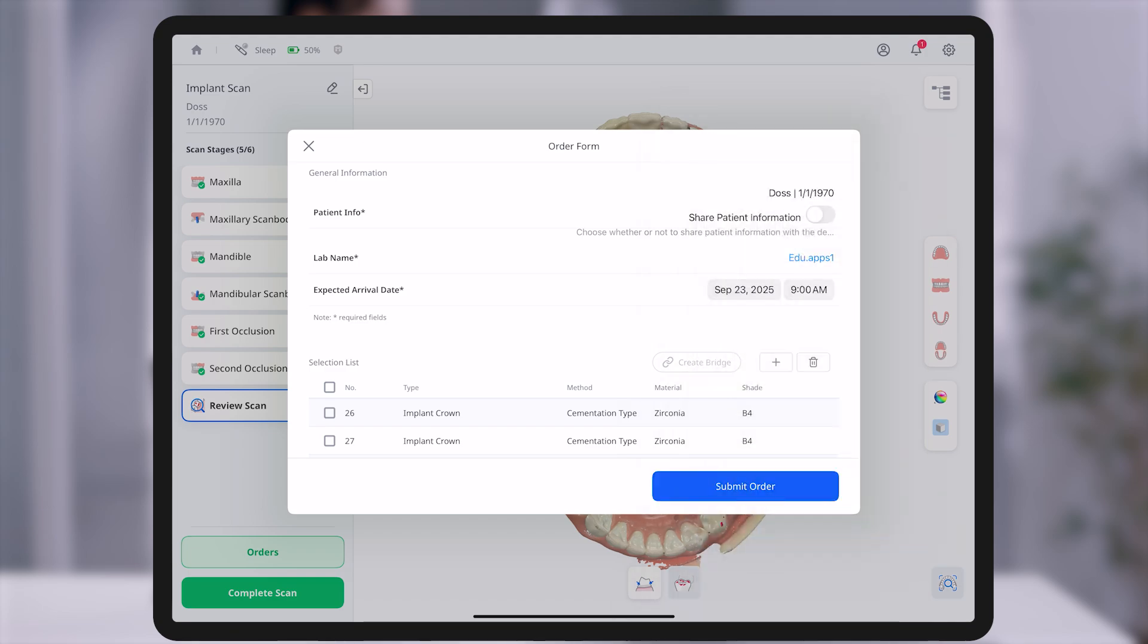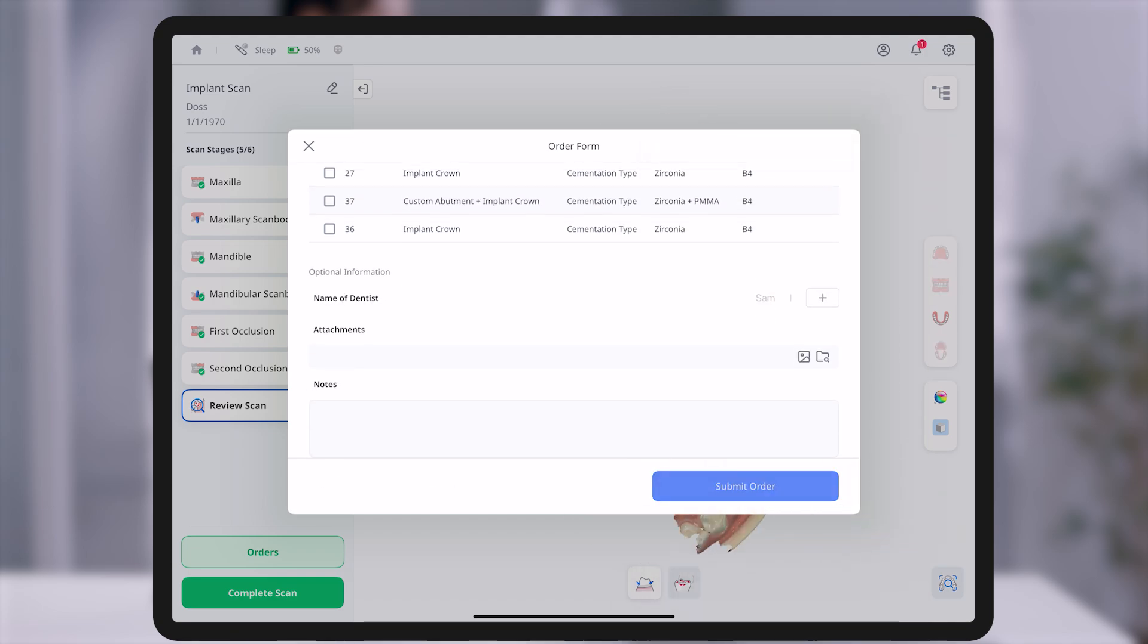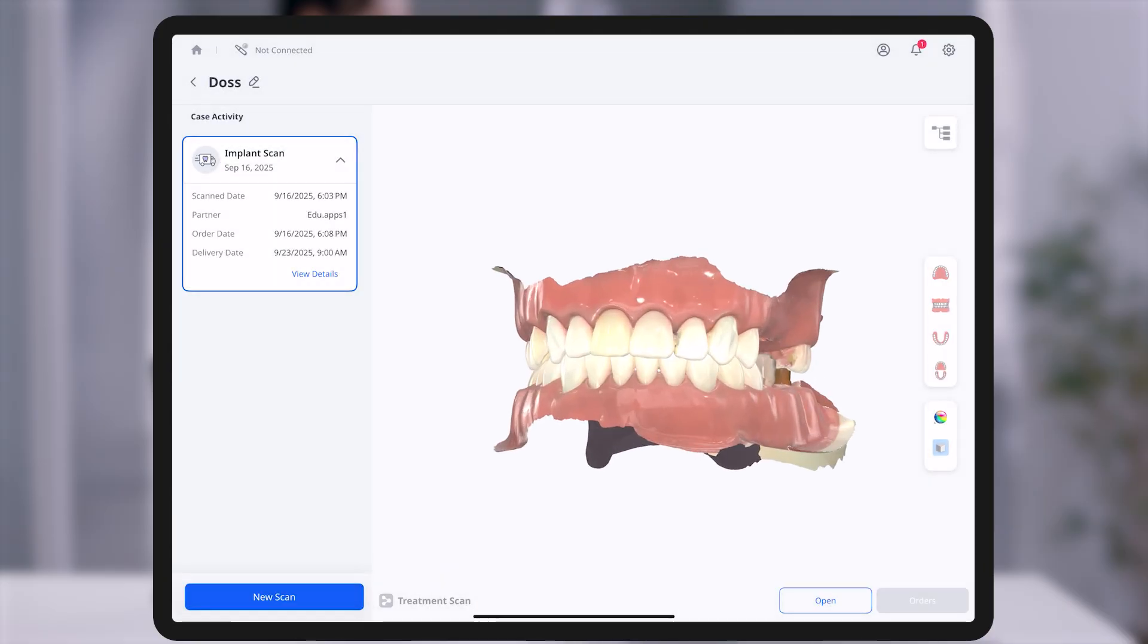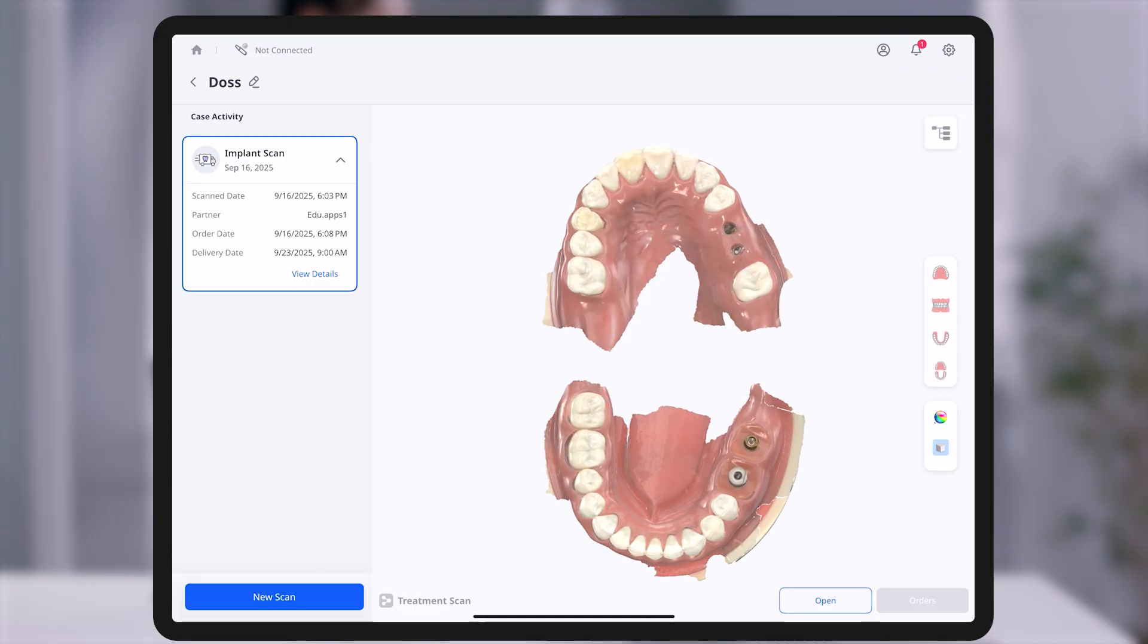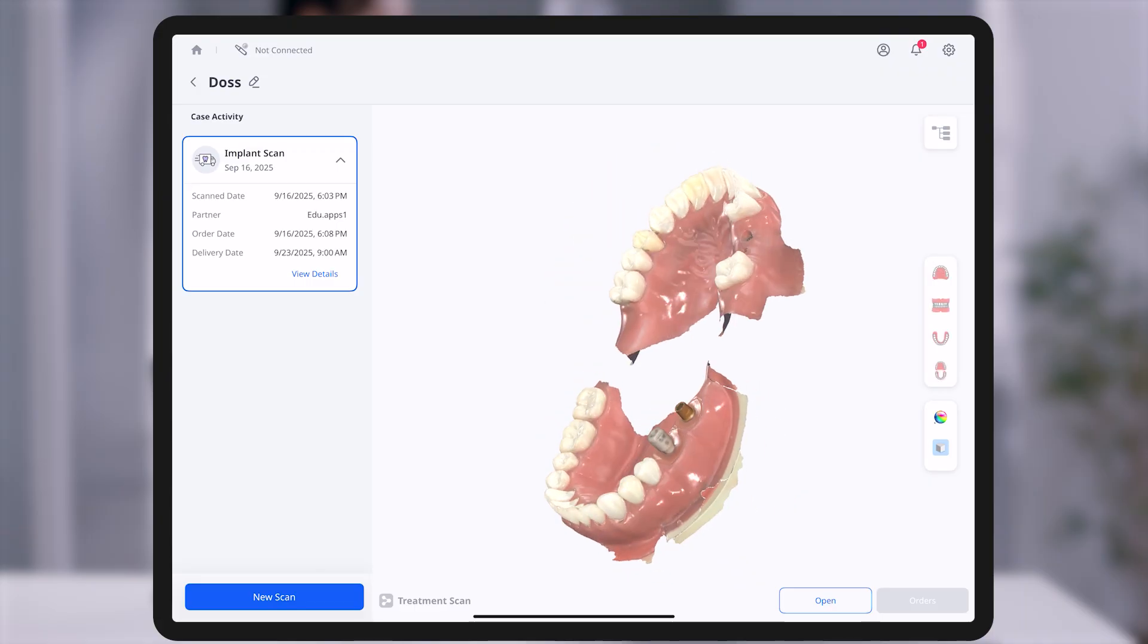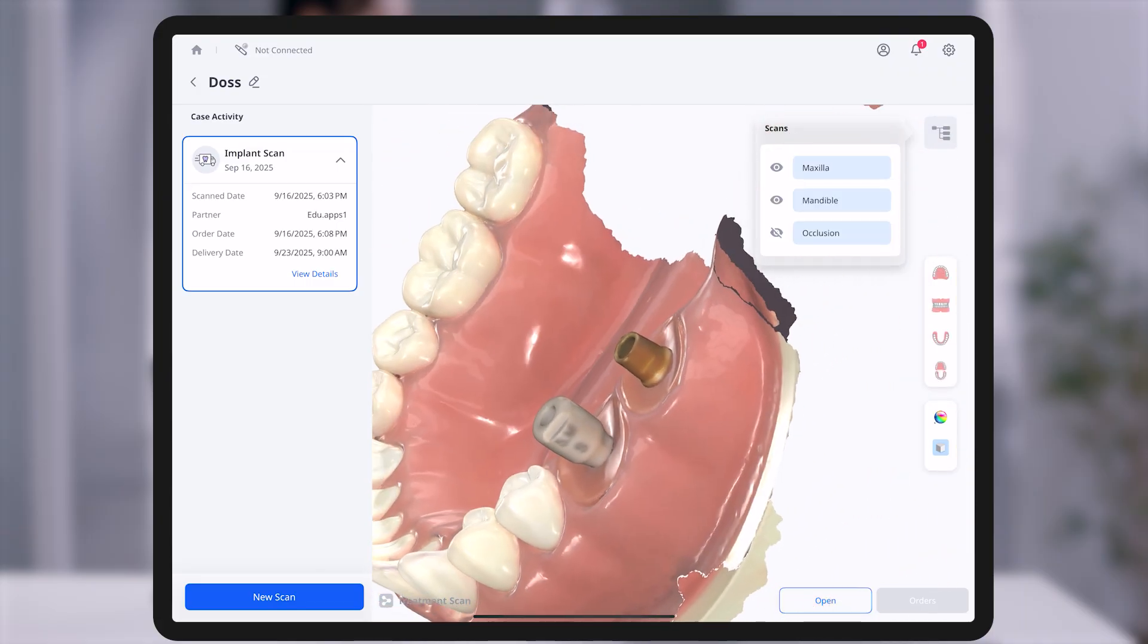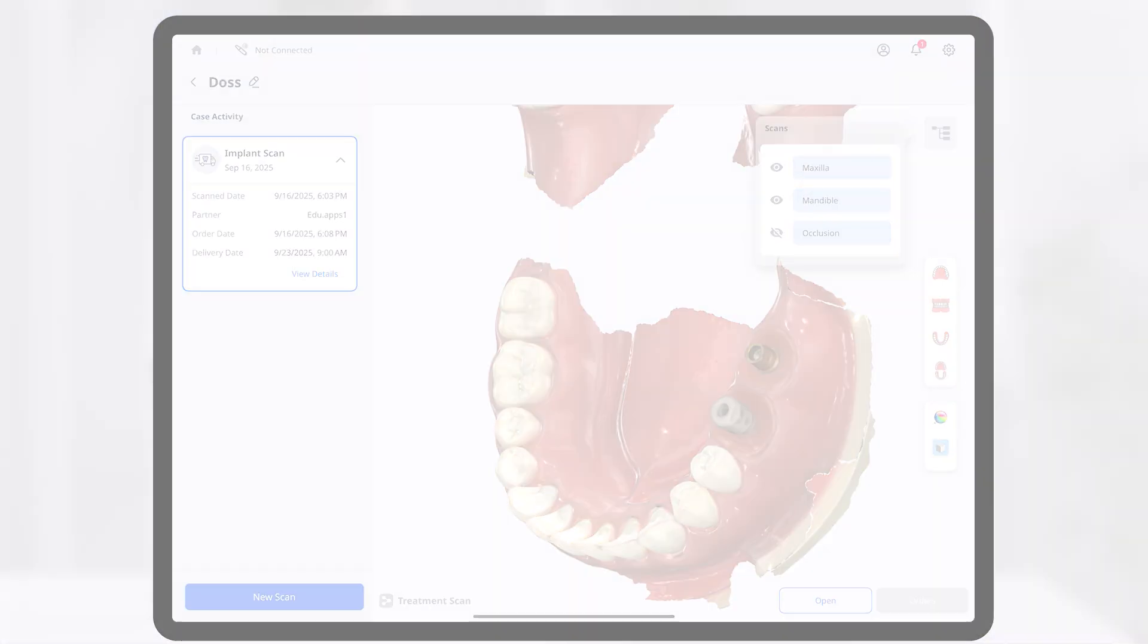ExpressScan is well-suited for quick and simple consultations, while TreatmentScan provides a detailed workflow ideal for accurate diagnosis and treatment planning. When your case requires patient registration, customized scan stages, and streamlined ordering, choose TreatmentScan. Selecting the right mode based on your scanning objective is essential.